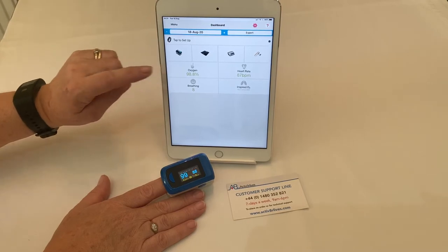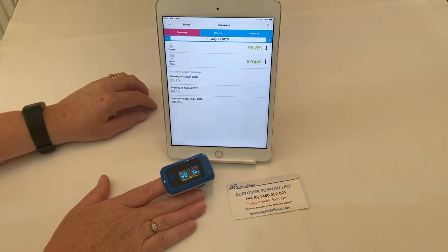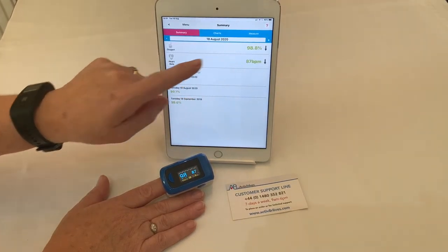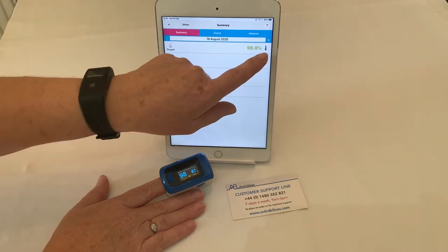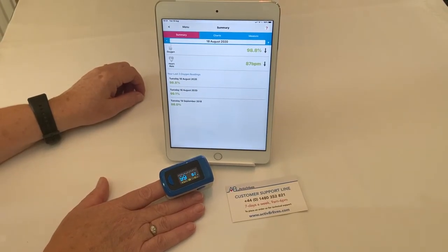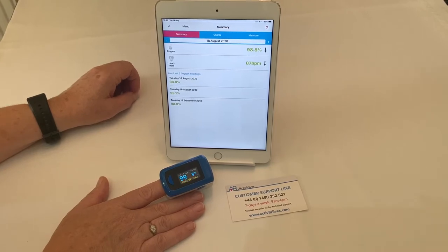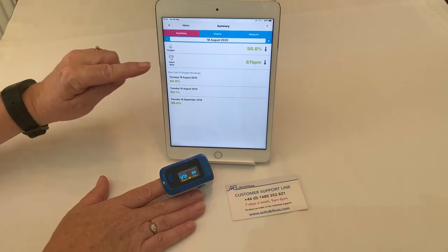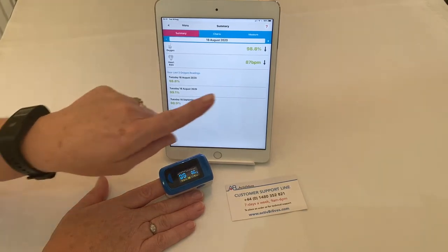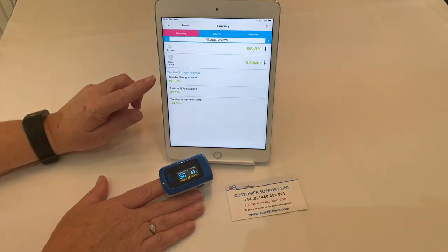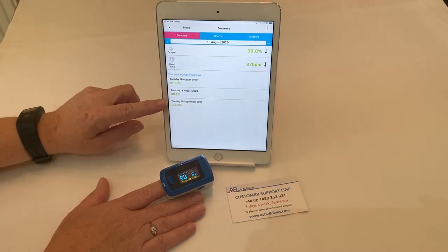To look at your data after a reading, touch oxygen from the dashboard and you can see that the SpO2 is in green with an arrow going down, which indicates that it's within normal range because it's green and slightly down from the last reading. The heart rate again is in green and slightly lower than the last reading, but both in normal range. These are the last three readings.